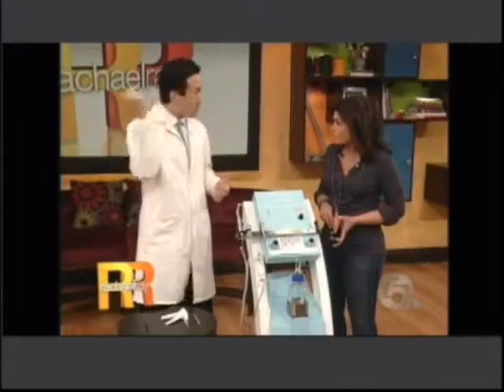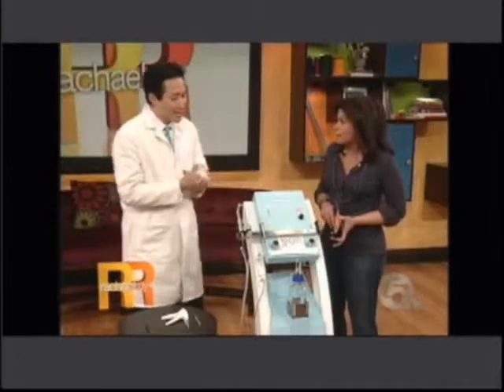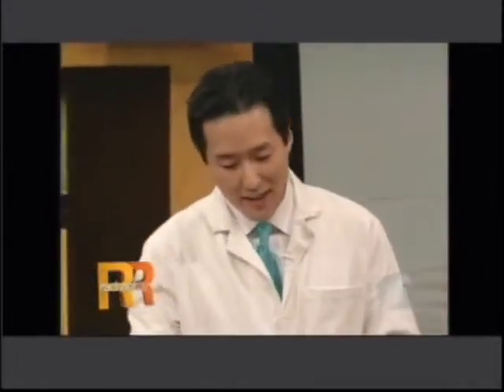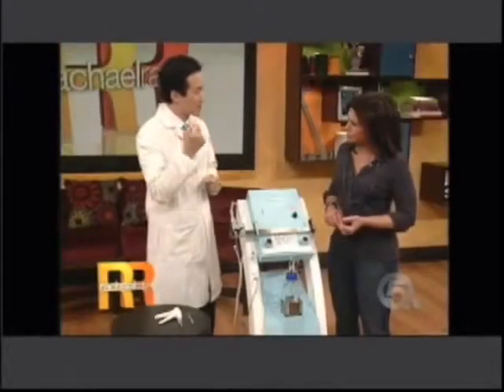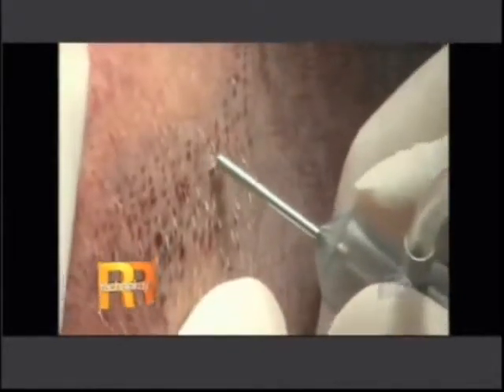Okay? That sounds incredibly painful and time-consuming. It's very tedious. It is such a pain that it makes me want to pull out my own hair whenever I have to do this thing. So now this machine is called the Neograft, and this basically does away with cutting out the strip. It does away with the staples. It does away with the scalpel, stitches, and all that. And what it's based off of... Oh, there it is there.